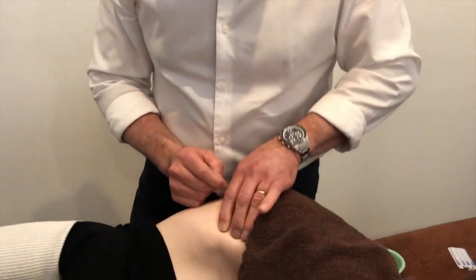What do we do? What are the techniques that we can use to get through that tissue and achieve either a twitch or getting some ache or referral to simulate a familiar pattern for that patient? Well, I've got a few tips and tricks here for you. So we're going to have a look at this very nice muscle right here.